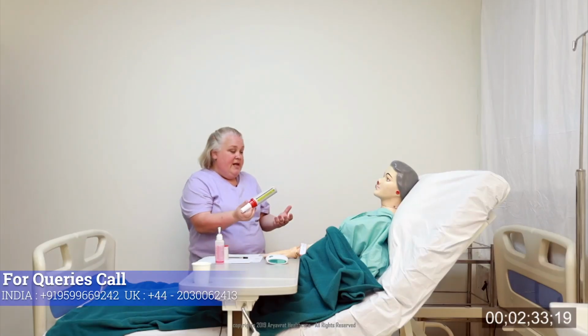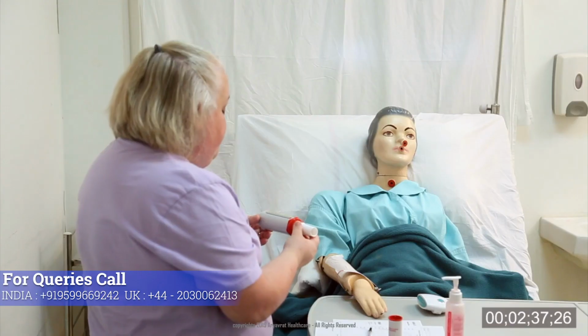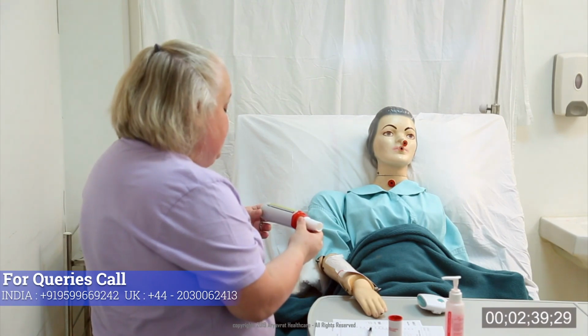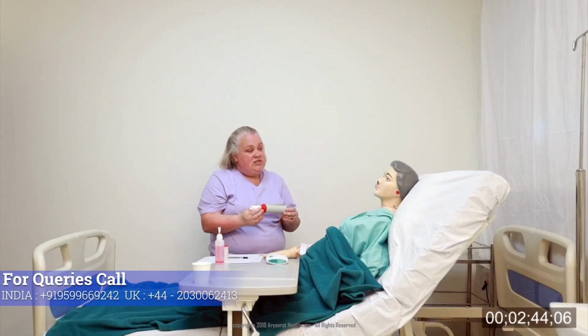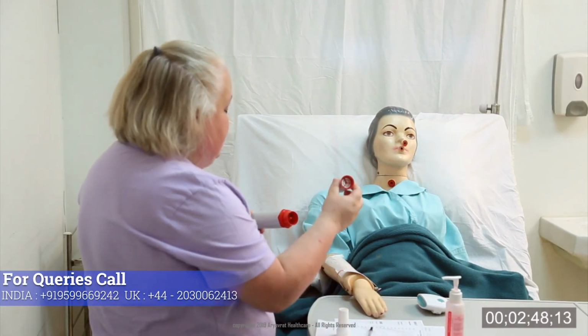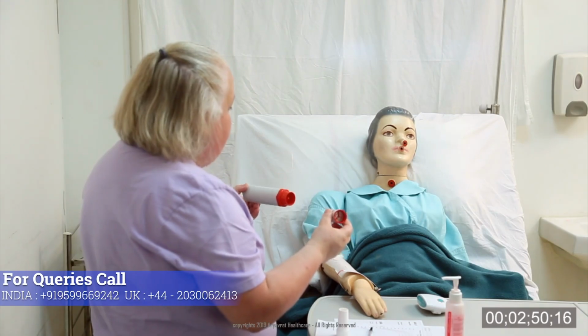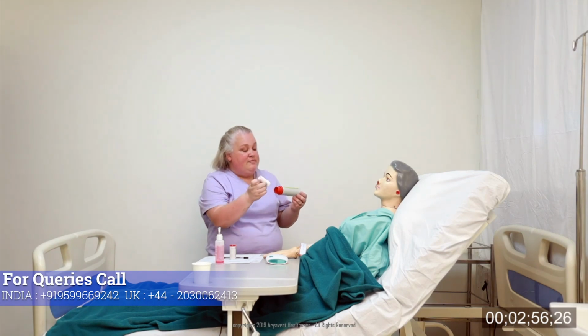Okay, so let me explain this device to you. It's a very simple device. On the ward you may well see us using it. When we use it on the ward, we will use these disposable mouthpieces and the same machine. But when you get issued one to take home with you, it will be your own, and you'll have one of these plastic mouthpieces which is reusable.